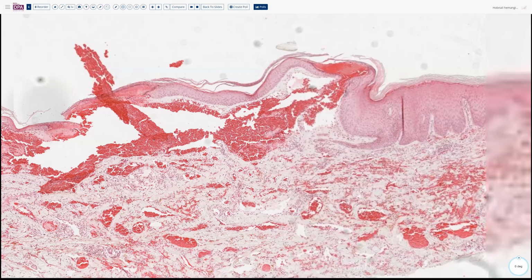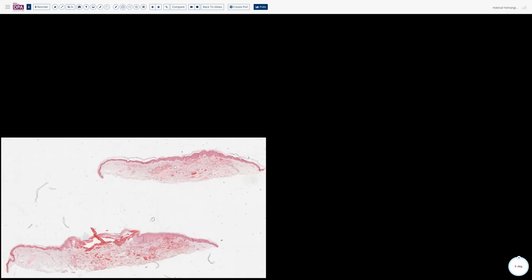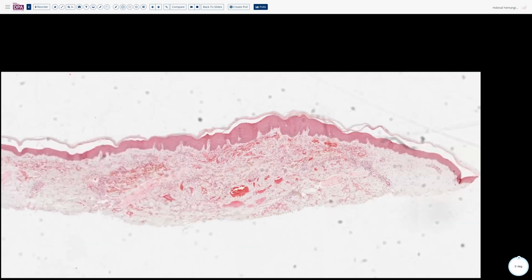If you find a really good one from this, a little matchstick, or what you think is a truly ideal hobnail cell in this slide, please photograph it and send it to me to prove that you made it here to the end of the talk, and that you were able to apply what we talked about in finding a good matchstick.